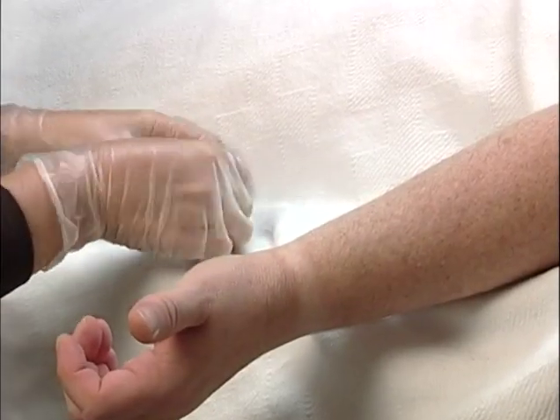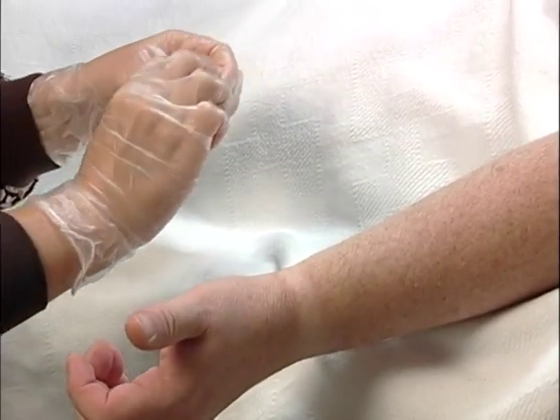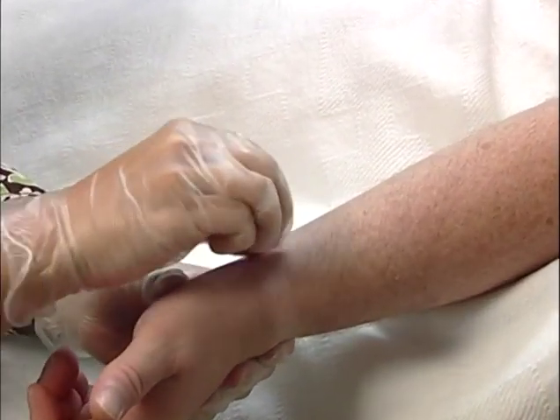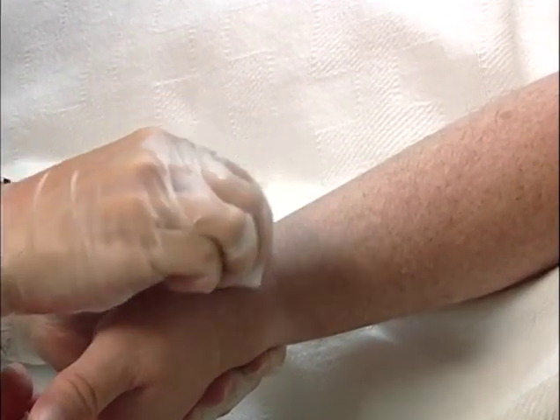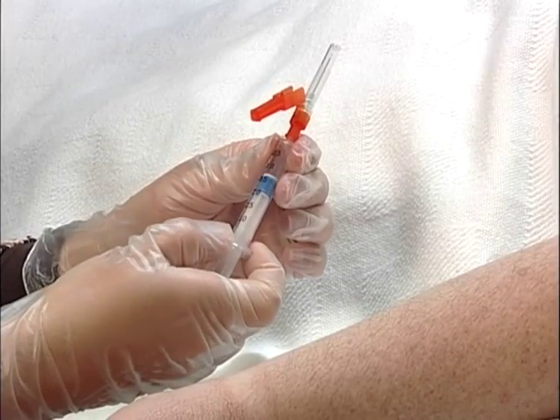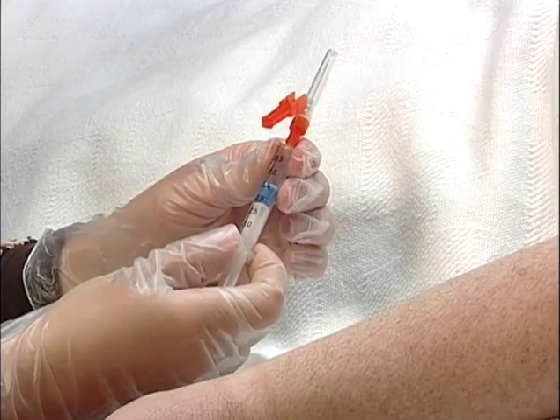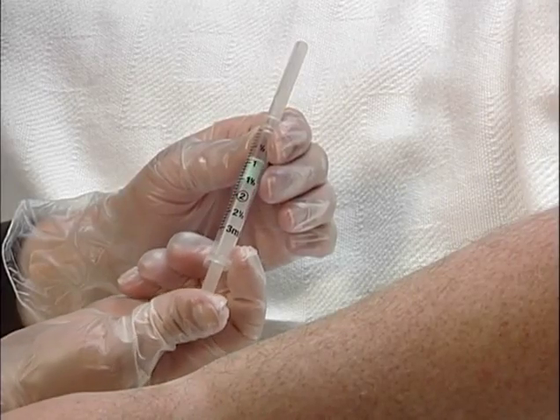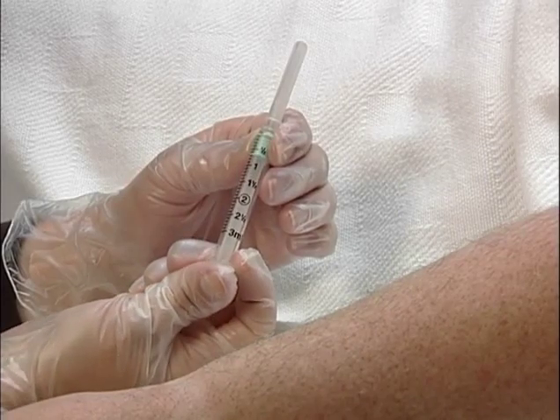Cleanse the skin above the artery with alcohol or other appropriate antiseptic, according to your facility's policy. Allow the antiseptic to dry. If the syringe is vented, position the plunger to the desired volume. If not, expel the air according to the device manufacturer's recommendations.